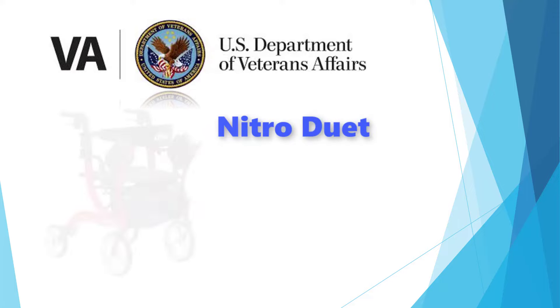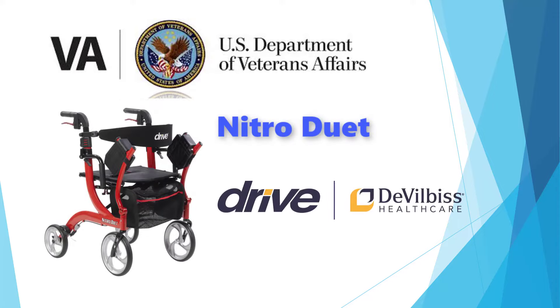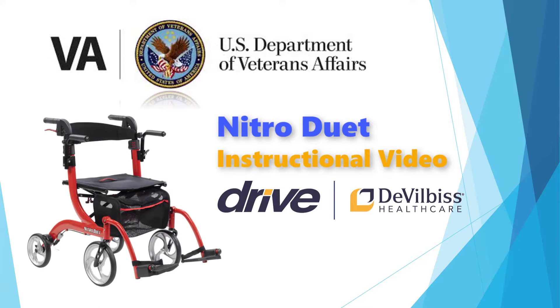Hello and thank you for choosing the Nitro Duet Rollator by Drive to Vilbis Healthcare. Your therapist at the VA will be providing you with a Nitro Duet Rollator as a walking aid to help you with your mobility. This will help you stay active and engaged in your normal daily activities while giving you the ability to sit and rest when needed. You also have an extra special feature that allows you to be pushed comfortably by a caretaker.